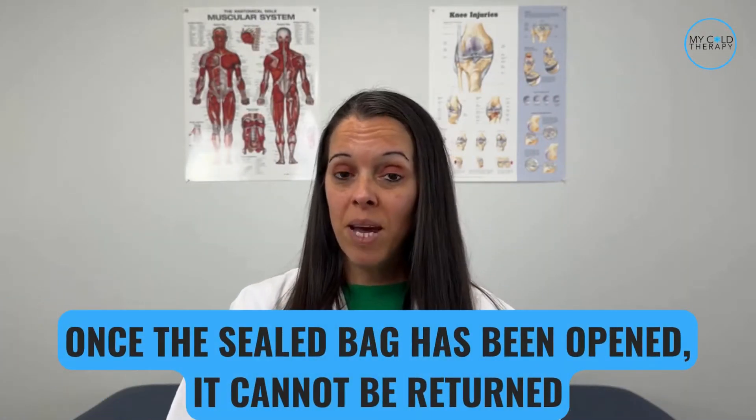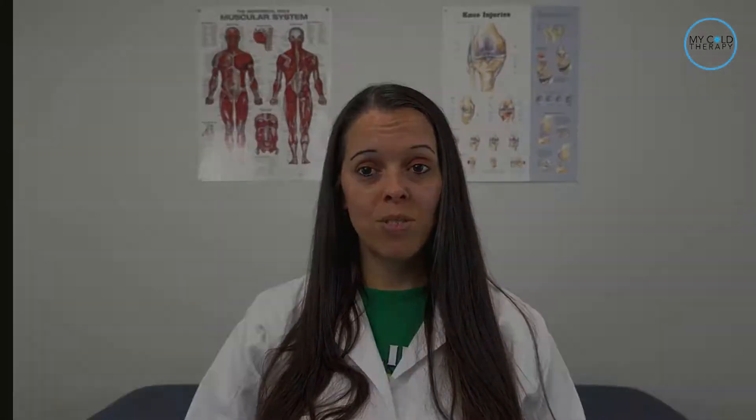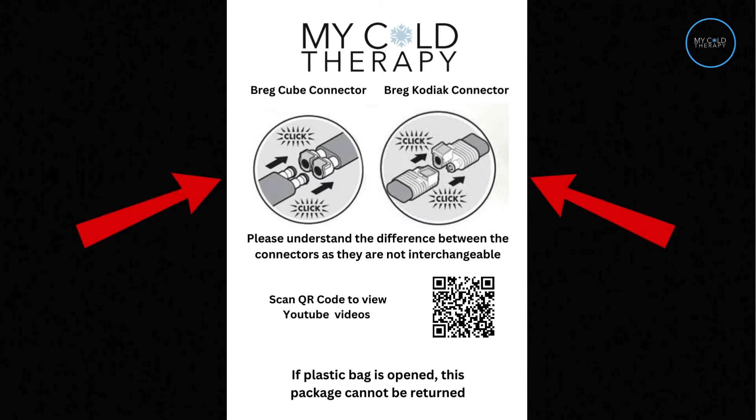Notice this is a sealed bag, and once the sealed bag has been opened, it cannot be returned. You will be getting a flyer with your pad that shows the different connectors — the Cube and Kodiak systems have different connectors — so please be sure to order the correct pad.